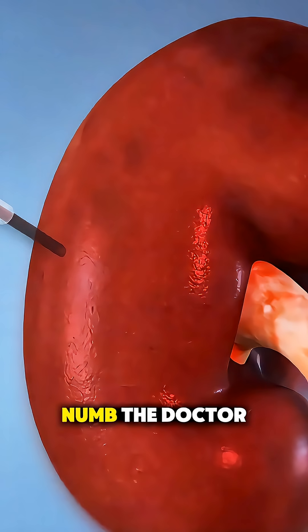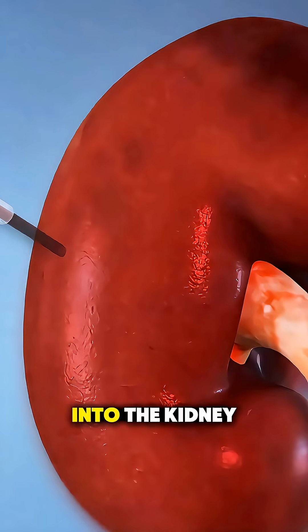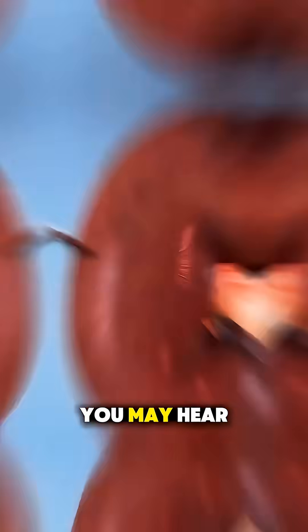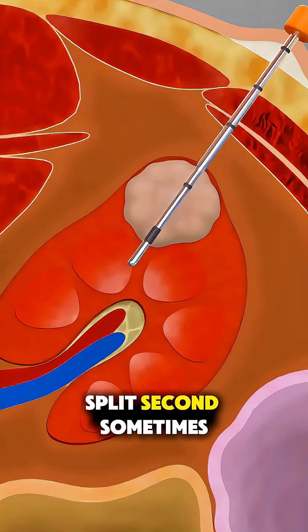Once everything is numb, the doctor inserts a thin, special needle through the skin and into the kidney to take a tiny sample of tissue. You may hear a quick clicking sound — that's the needle collecting the sample in just a split second.